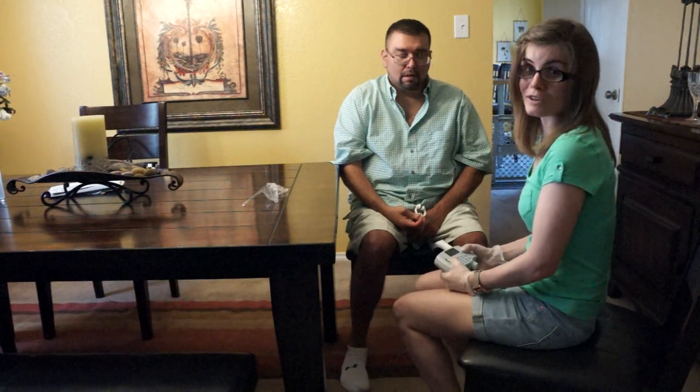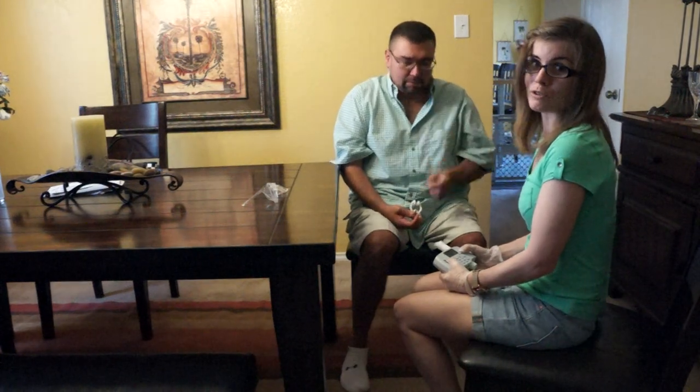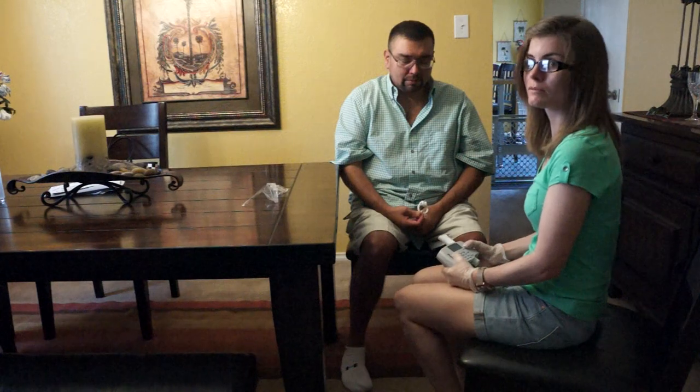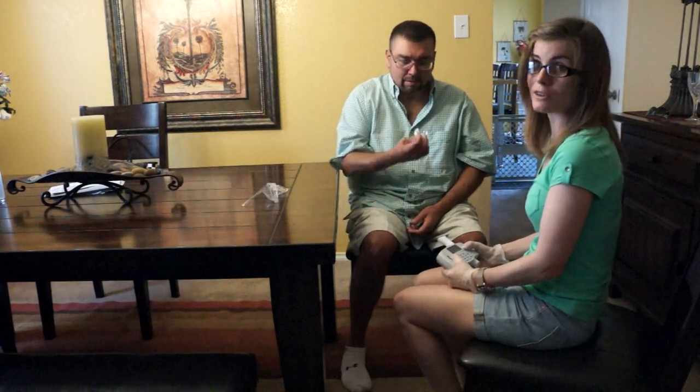So we'll make this one count. Of course, you want to encourage your subject to make sure that they give you good tests. The more encouragement you give, the better the test is as well. These tests are not easy, so it's always good to encourage your patients.